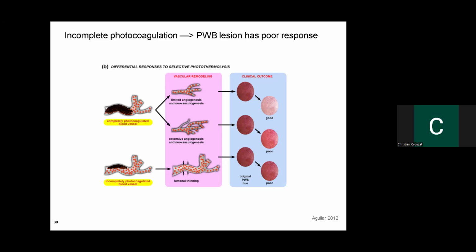What's that? Oh, in the skin, during the treatment. So you're asking if there are any clots during the treatment. I am not 100% sure on that. The skin is fairly, at least compared to the brain, low in vascularization. Yeah, I would think so. But again, a lot of the targeting here is the smaller blood vessels that we're able to monitor with LSI, rather than the deeper arterioles, especially in the skin.